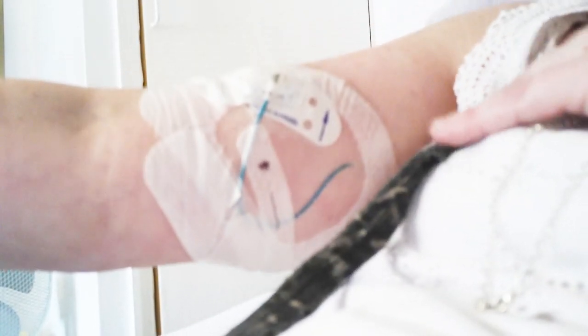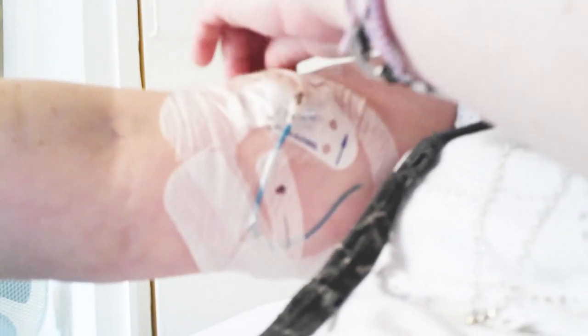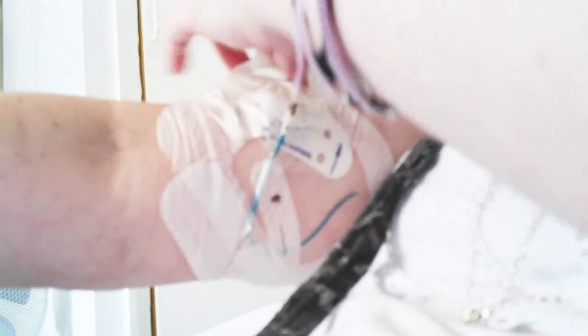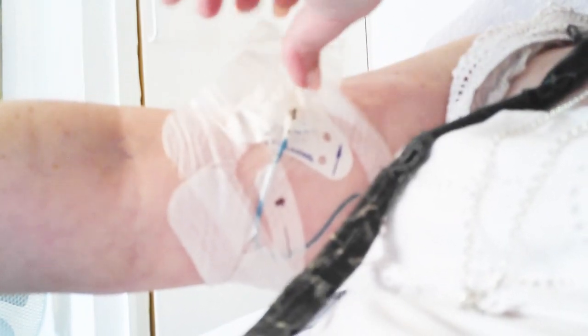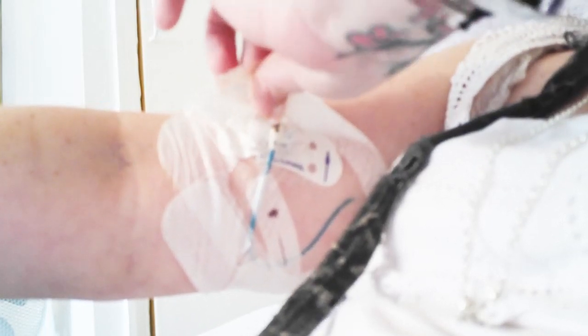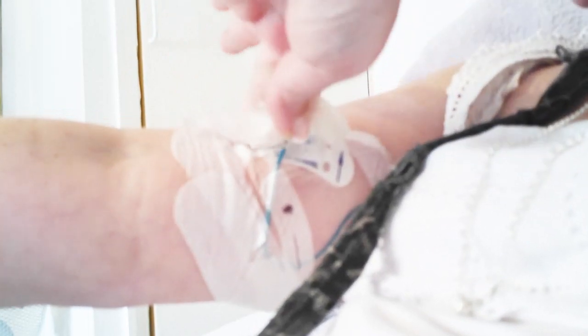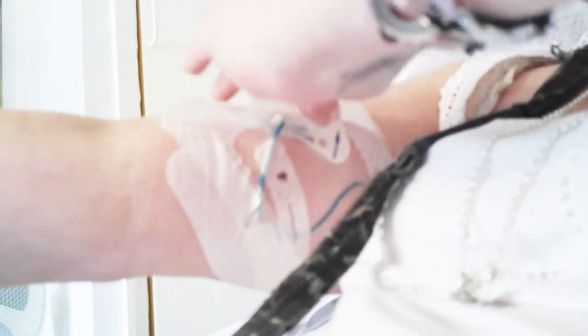it's all still wrapped up at the moment. I need to get all that off. Start pulling it all off. I actually hate dressing my PICC line. It's a pet hate of mine, because if it's not one tube, it's another, but at the end of the day, it has to be done.